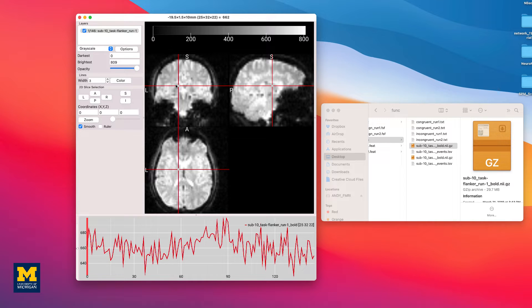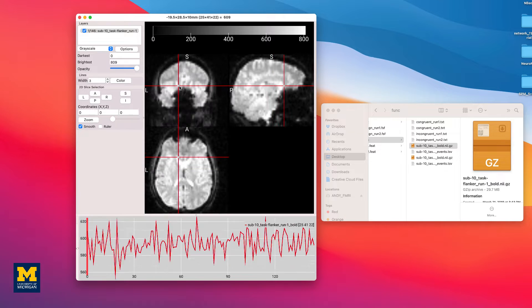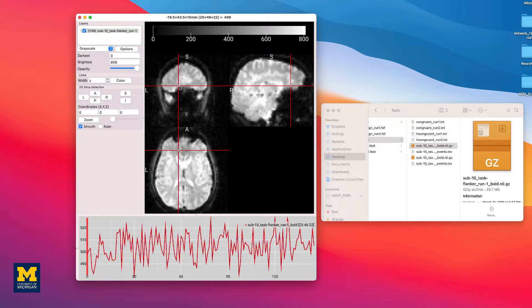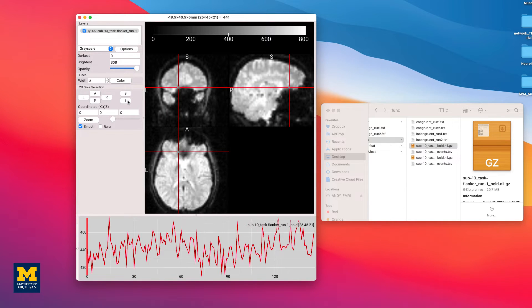Holding the CTRL key while scrolling allows you to zoom in and out of the image. Scrolling one image at a time can be done manually, either through the left and right arrow keys and up and down arrow keys, or by clicking on the L, R, A, P, S, and I buttons in the 2D slice selection sub-window.